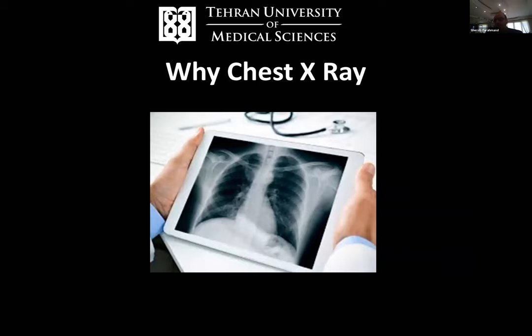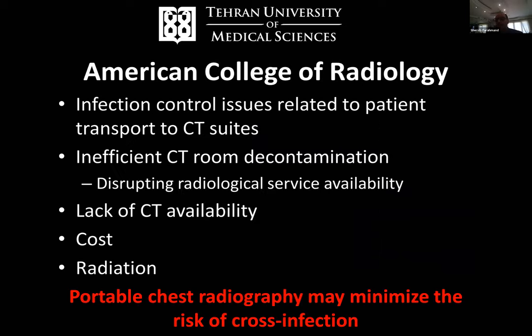To clarify the reason, I rely on the recommendation of the American College of Radiology. The main issue for them, as Dr. Hariri said, is contamination and transporting of infection and virus to other patients. Infection control issues related to patient transport to CT scan suites are very important and may be dangerous for other patients or even for personnel of CT scan rooms.